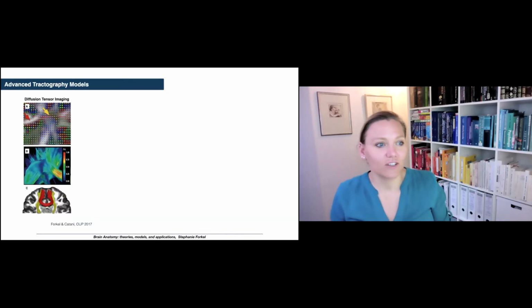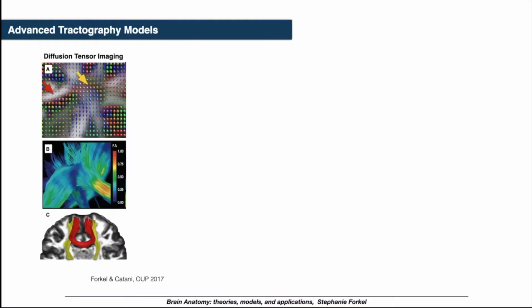So to show that to you in a more mathematical way, rather than just with my arms, you see a map here in the top panel. You see for every voxel the DTI reconstruction, and we usually call that the Smarties because it looks like Smarties. And you can see, shown by the red arrow, the corpus callosum, they all nicely follow the trajectory and we get a crisp reconstruction. However, if you look at the yellow arrow, we're now in that part where the corpus callosum comes out, the corticospinal tract is coming up, and you have association fibers running along as well. So suddenly there's a lot of crossing, and what you see is that the Smartie in those boxes around that region is not anisotropic anymore, but it turns into a sphere. So in that case, we don't really know where to go anymore.